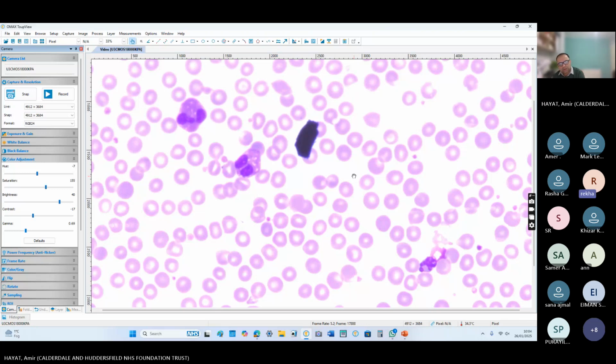How to complete it? I'm actually not getting it. You have commented on the blood cells. What is this? What is your impression? And what is your suggestion? The GP has sent this blood film to you.